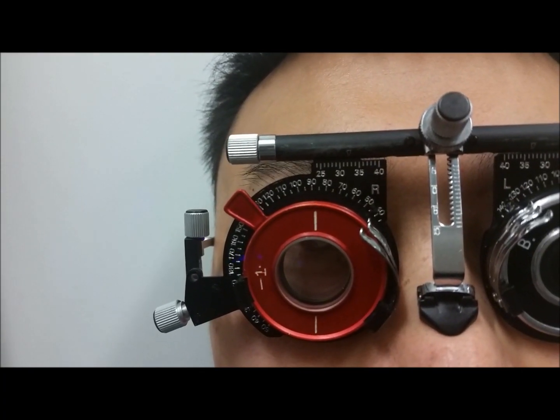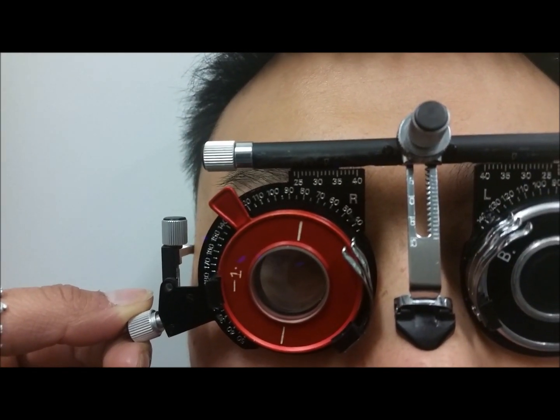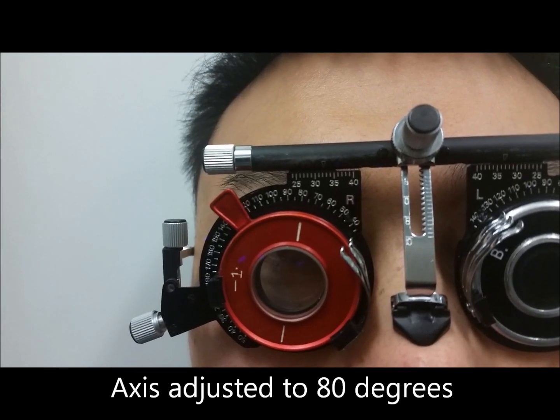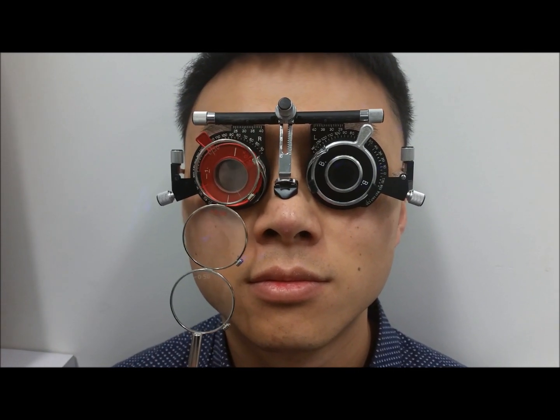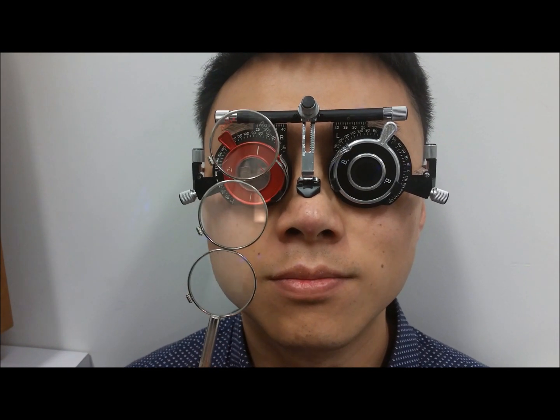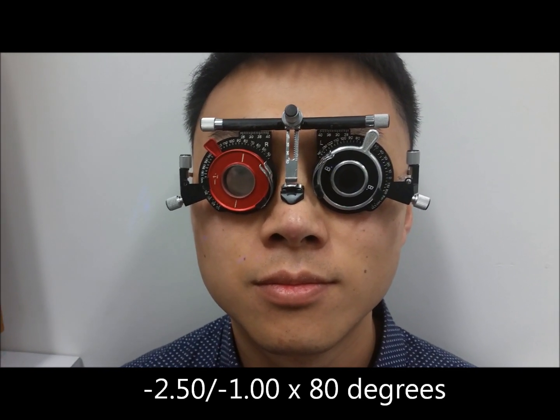The correcting cylinder axis is now rotated towards the minus Jackson cross cyl axis in the patient's preferred position, in this case number 1 position, by approximately 10 degrees. And I just want you to tell me the same thing again. Is it better number 1 or number 2, or are they both the same? Both the same. Now that equal blur has been achieved, we have now established the patient's cylinder axis.